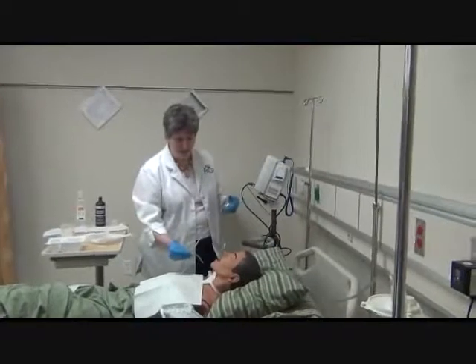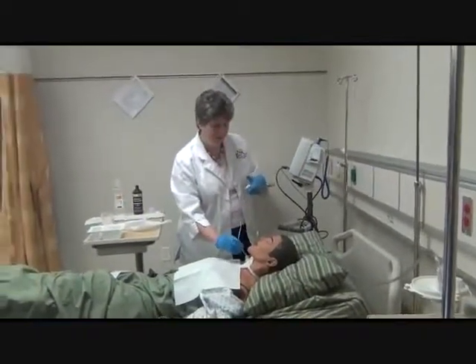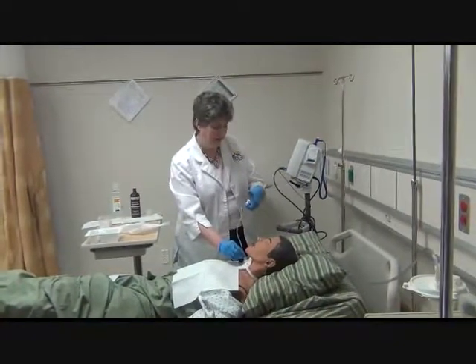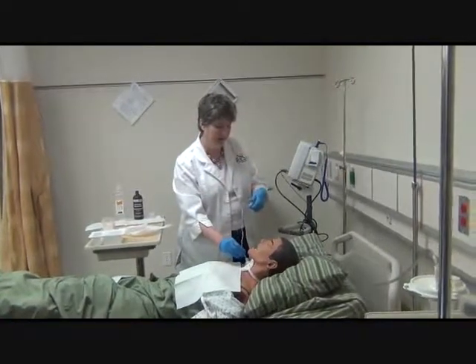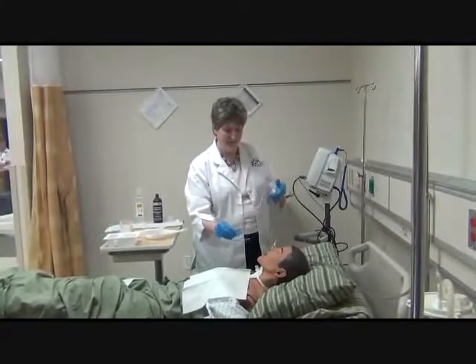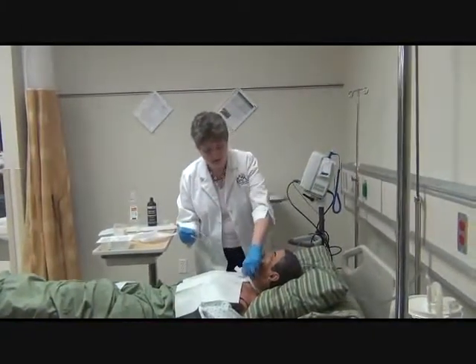So for demonstration purposes, I'm going to pretend that that's gone past. And again, tell my patient what I'm doing. I'm going to put the catheter in. You're going to feel pressure and suction. And again, as I get to the level I want, I'm going to apply the suction. Come out. Again, put back the oxygen on.